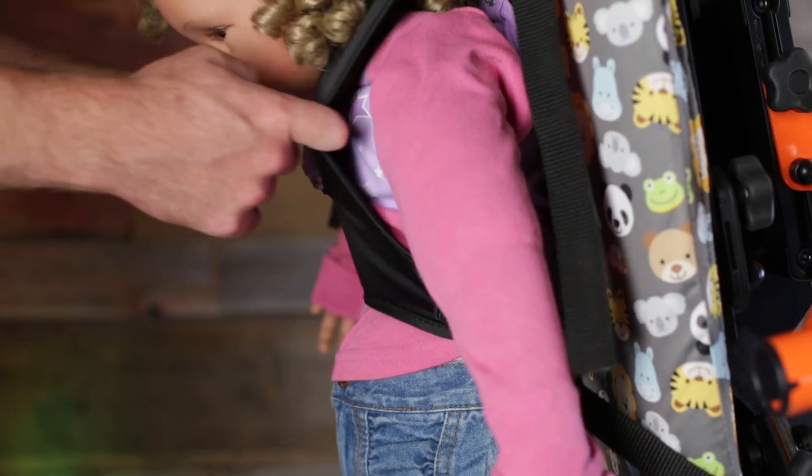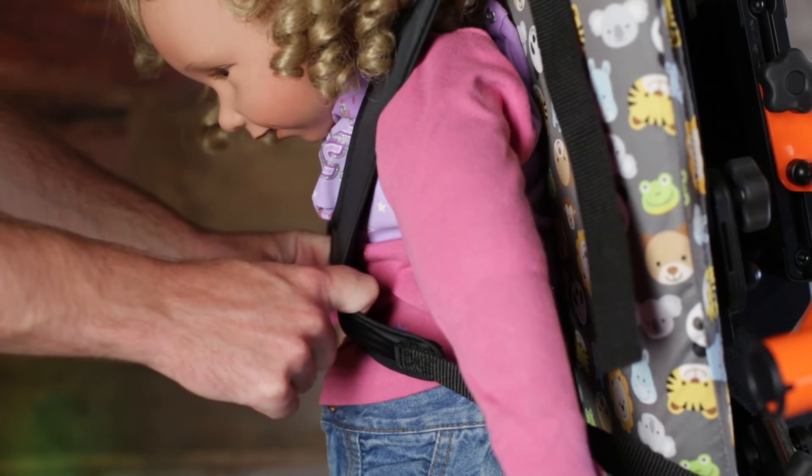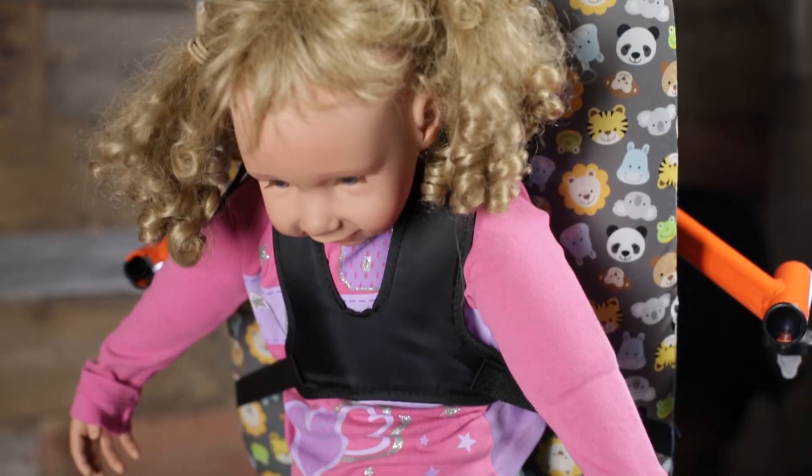With the quick release buckle, the user in the supine position can be transferred from the unit without hassle.